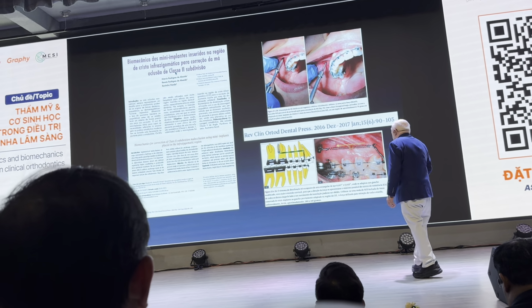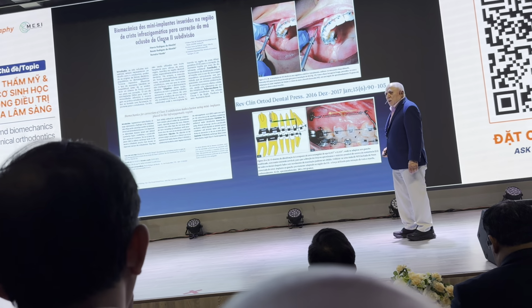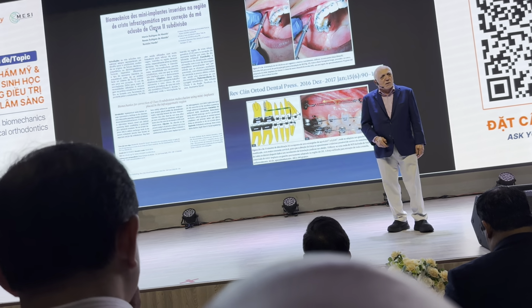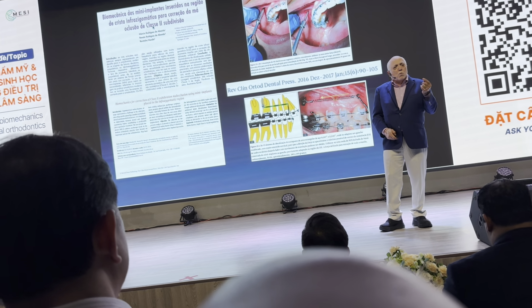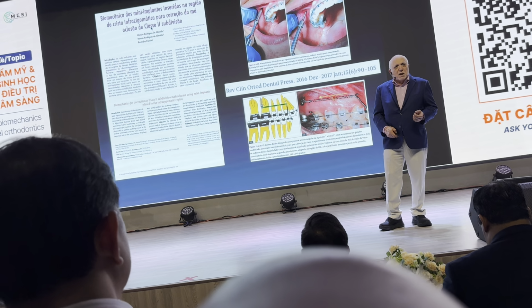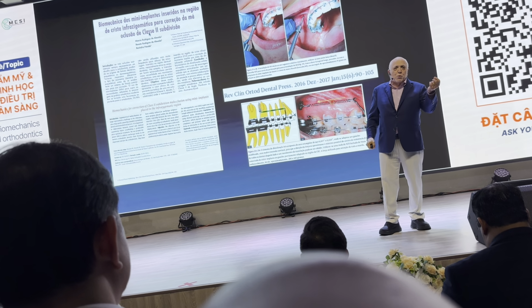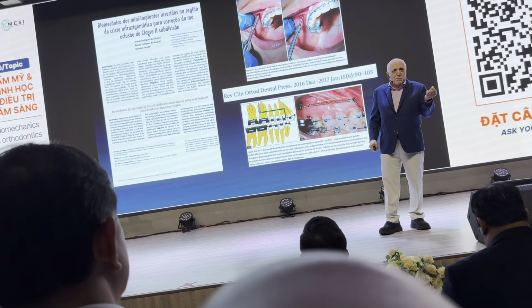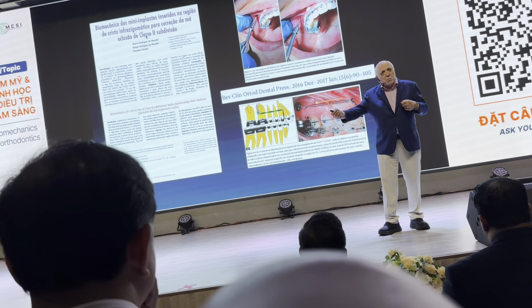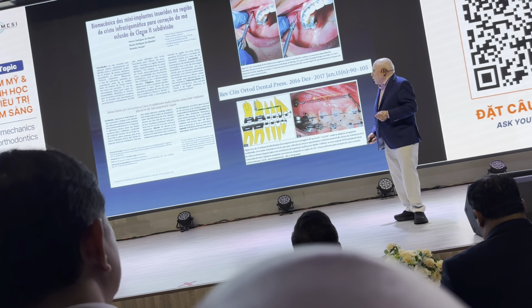So it becomes very important, using infrazygomatic screws. It takes about 1 minute and 34 seconds actually putting the screw in. It takes another 4-5 minutes to infiltrate with local anesthetic. And you can start applying the force right away after that without any problem.